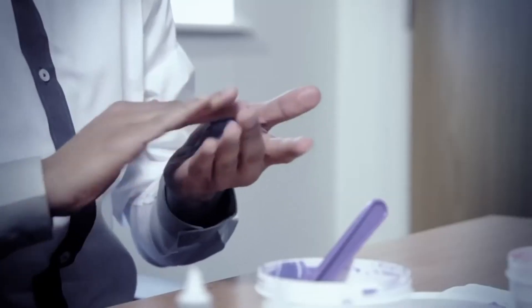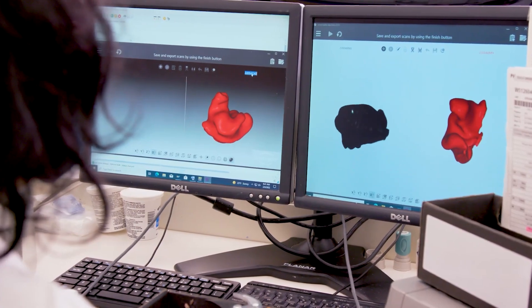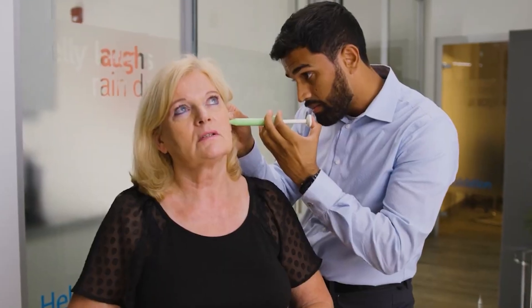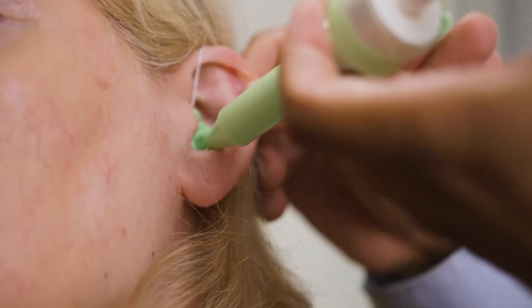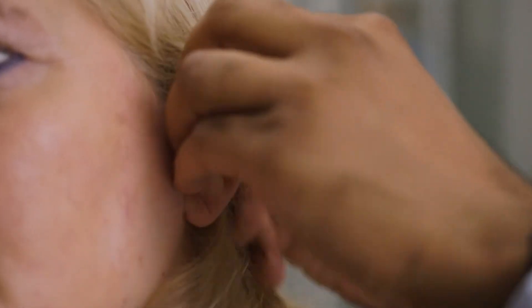The next step is to make a mold for the ear canal. This is done so the hearing aid can be designed to very precise measurements. An auto-block is inserted in the ear canal to protect the eardrum from damage while making the mold. Once done, a silicone impression-making material is inserted into the ear, and once it solidifies, it is removed from the ear.